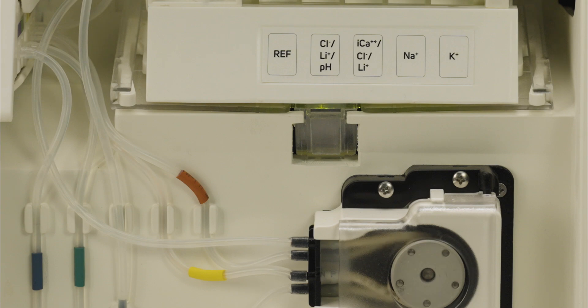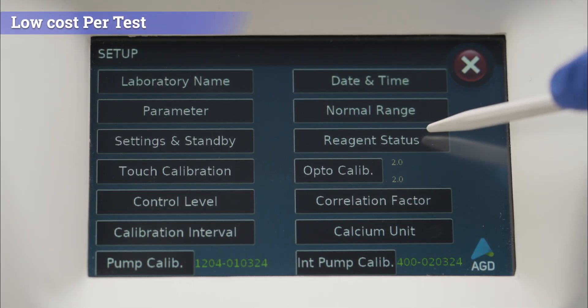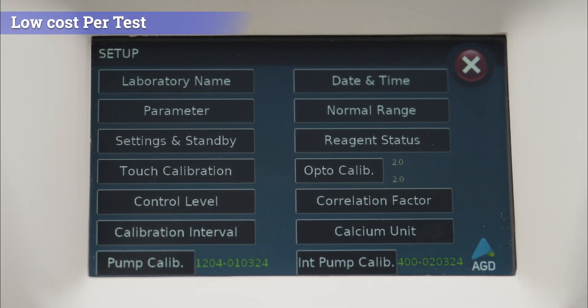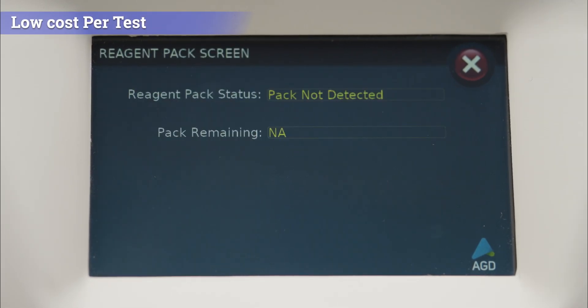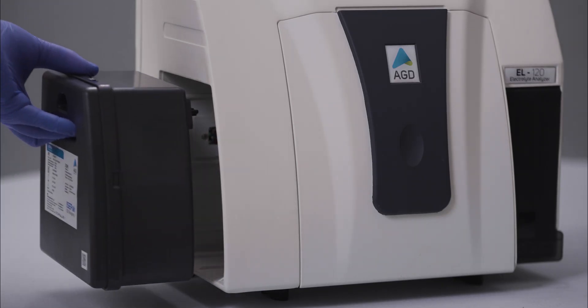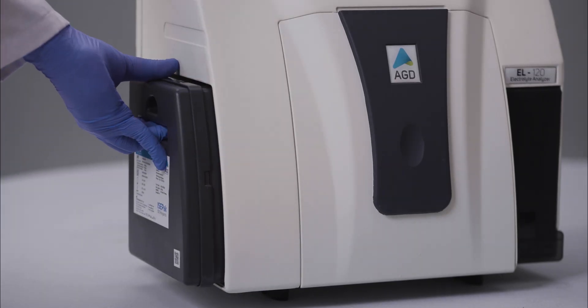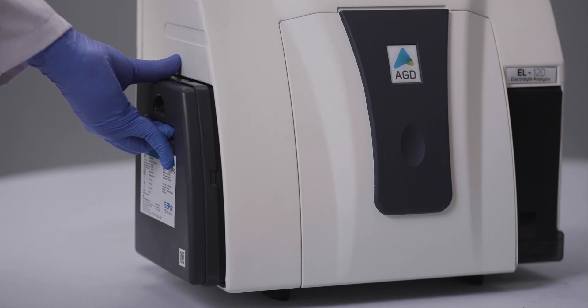Our reagent pack, ISE pack, is a closed and compact pack with an onboard reagent tracking system, where you can easily monitor and manage reagent usage, optimizing efficiency.